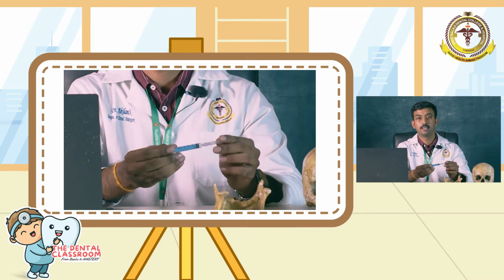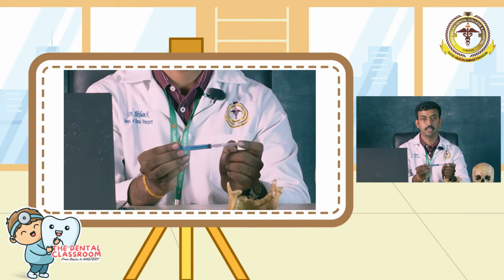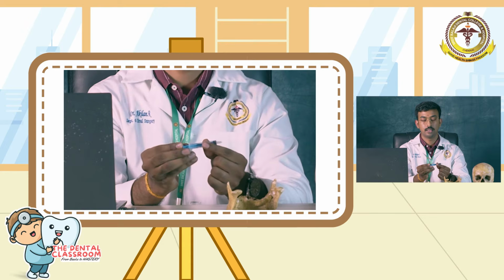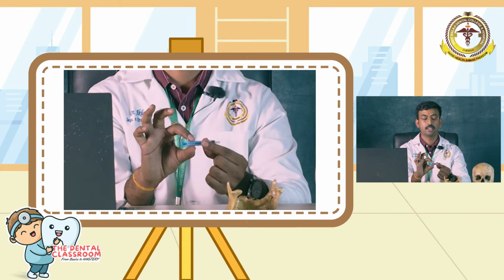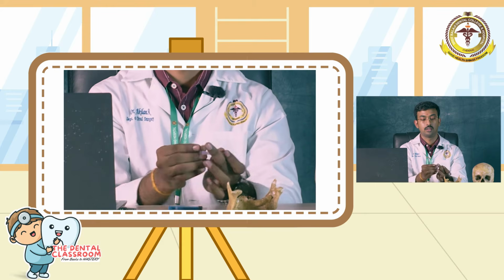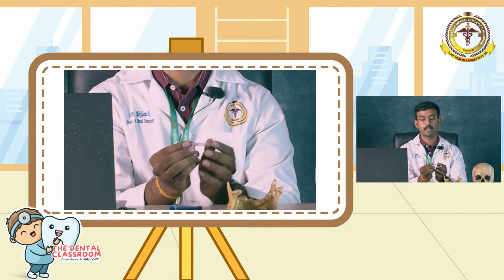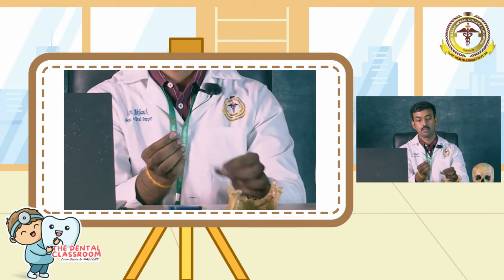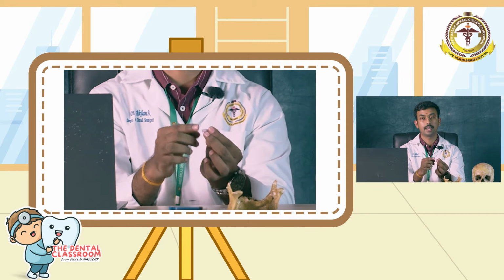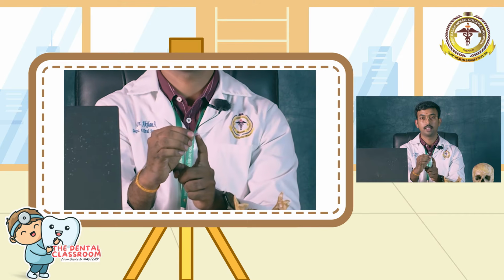Coming to the parts of a syringe, what I am holding in my hand is a single use disposable hypodermic syringe with needle. This is the syringe, this cylindrical portion is called the syringe barrel, and this is the piston, and this is our needle. What I am holding here is a short needle. This plastic portion is known as the syringe adapter. The portion with the whitish area is known as the hub.